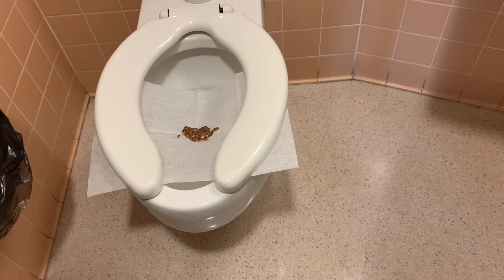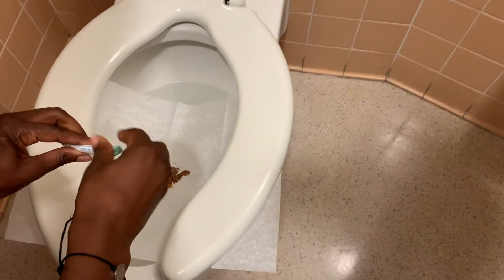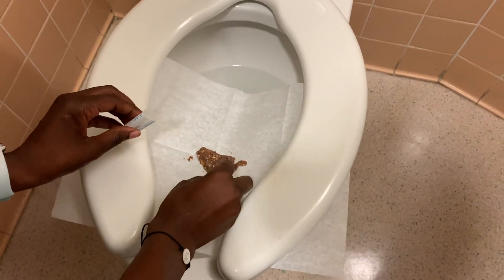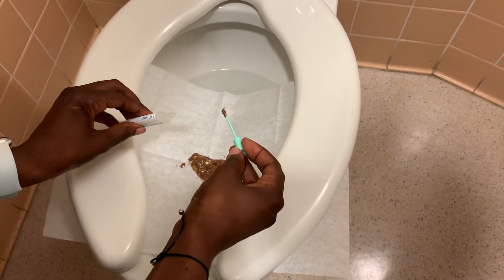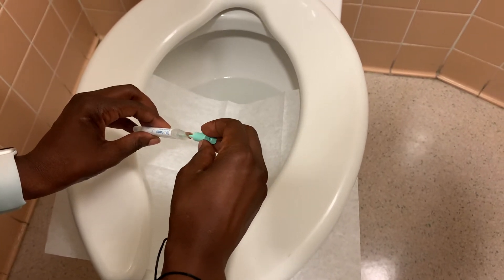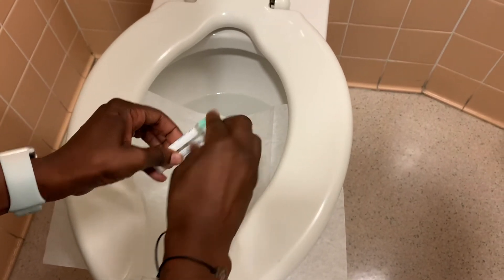After you've had a bowel movement, you're going to take the FIT kit and collect some stool, covering the entire tip of the kit.